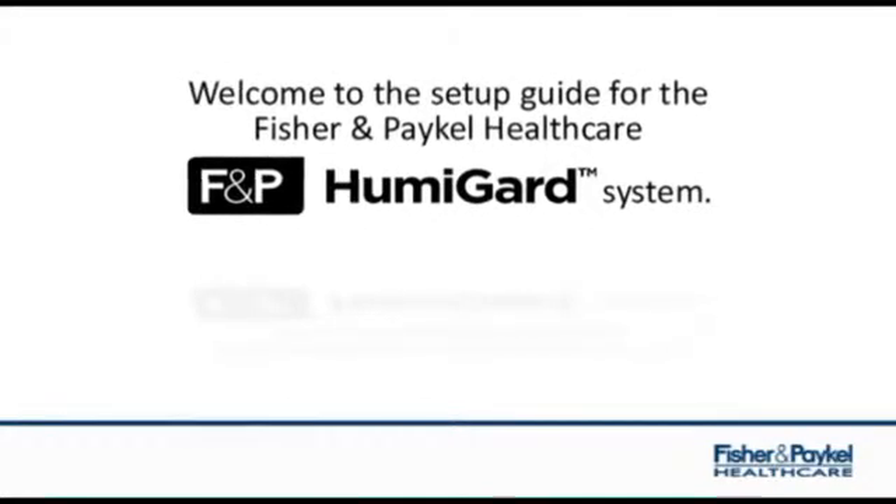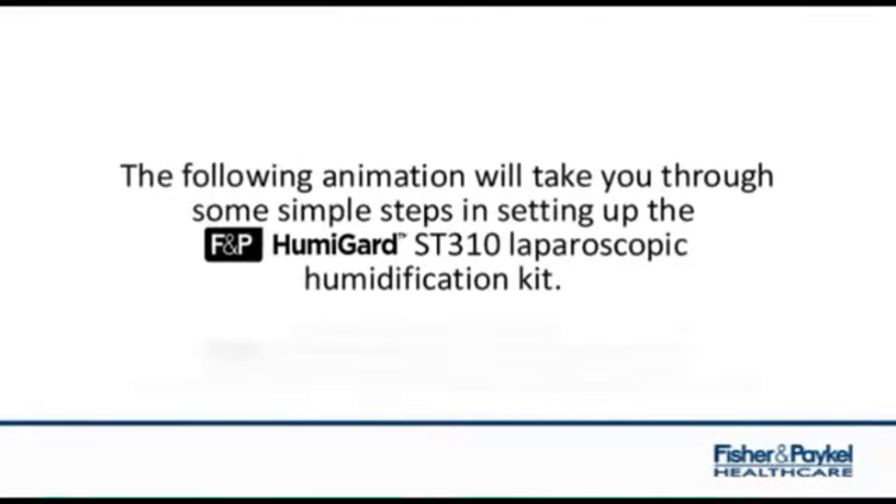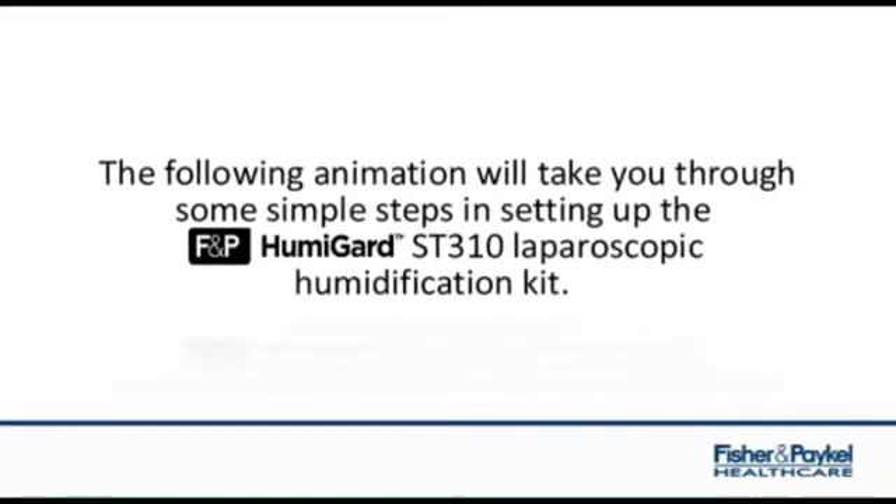Welcome to the setup guide for the Fisher & Paykel Healthcare Humiguard system. The following animation will take you through some simple steps in setting up the Humiguard laparoscopic humidification kit.